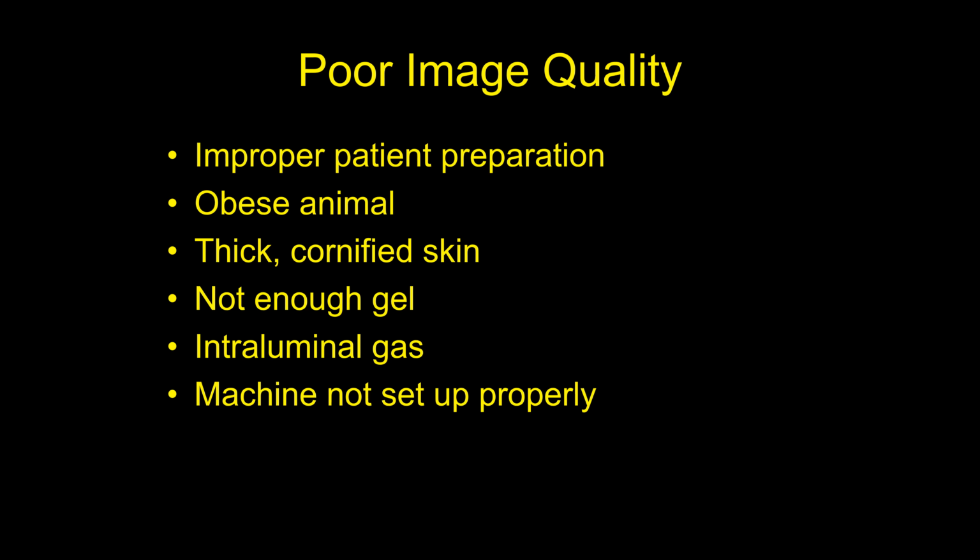Other things that will inhibit quality of ultrasounds, okay? Obesity, okay? If you have a really fat animal, the ultrasound image quality is going to just be poor, and there's not much you can do about it. It's just fat. On the other hand, the radiographs are going to be great, but the ultrasound is going to be poor, okay?